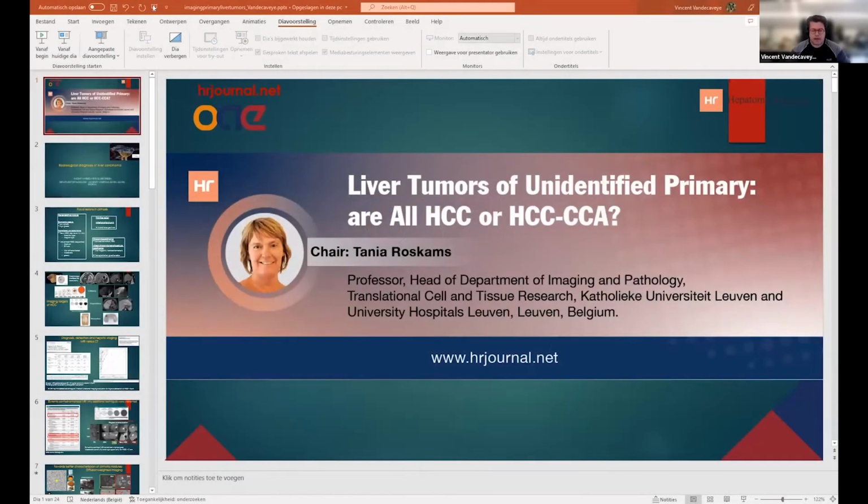So in the next 20 minutes, I will talk about radiological diagnosis of liver carcinoma. I will focus on cirrhosis. Lesions like focal nodular hyperplasia or adenoma in the non-cirrhotic liver are quite easily differentiated with MRI due to the advent of tissue-specific contrast. In cirrhosis, we have a different differential diagnosis.